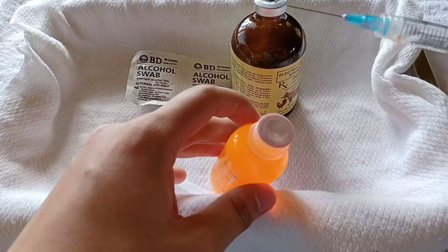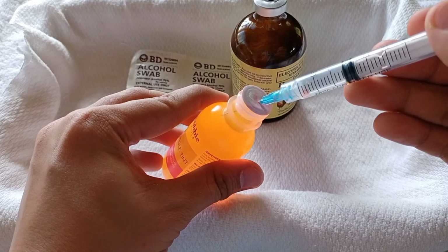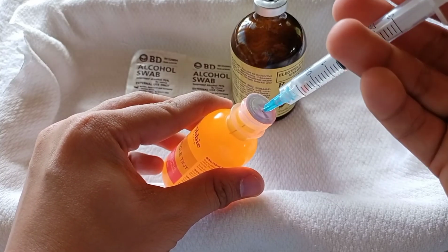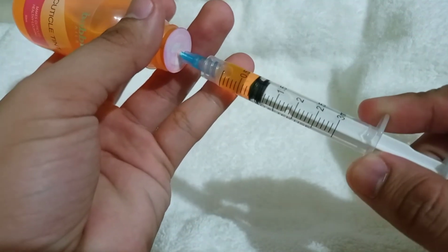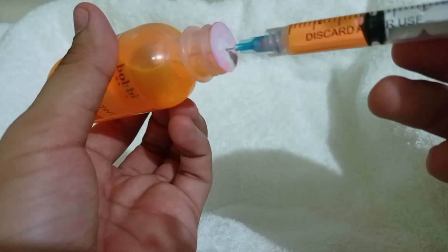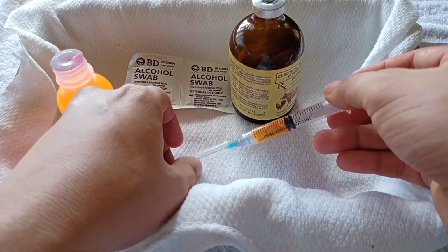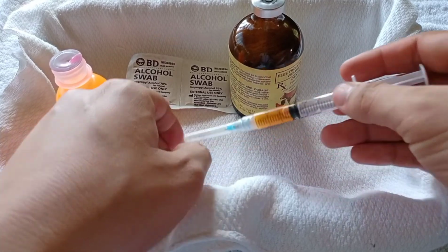Then you insert the needle through the rubber, then move the plunger down to instill the air, then invert it like this. Get the exact amount of medication. The exact amount of medication you are going to withdraw is the result of your drug calculations. Then do the scooping technique. Then you are now ready to give the medication to your patient.